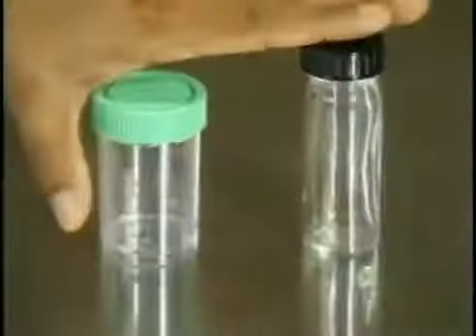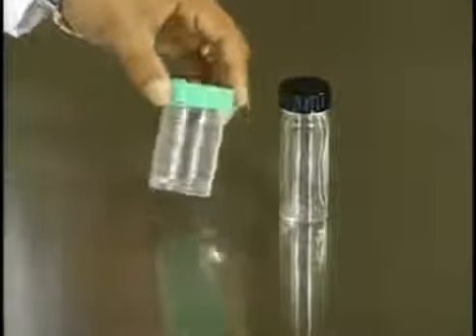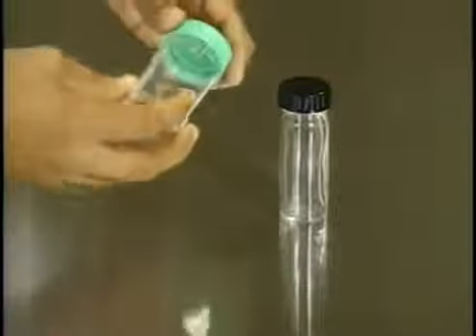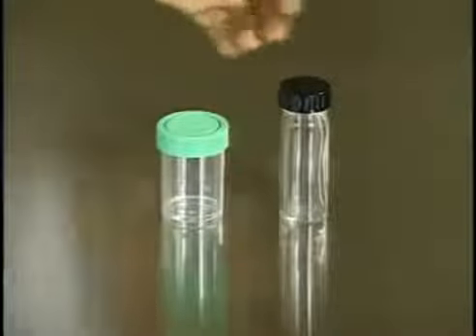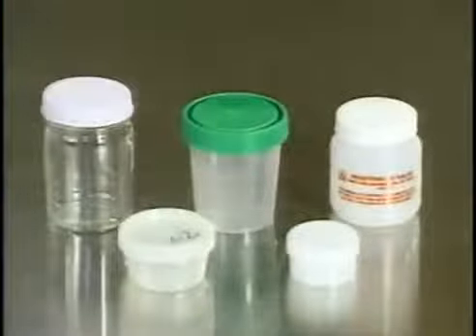Two kinds of containers are recommended for sputum collection. The first is a disposable, wide-mouthed, screw-capped container. It is made of unbreakable, transparent plastic. It must be hermetically sealed to keep the specimen from leaking and drying out. The second is a screw-capped universal container made of heavy glass which can be first sterilized, cleaned, and used again. Many countries use their own containers.